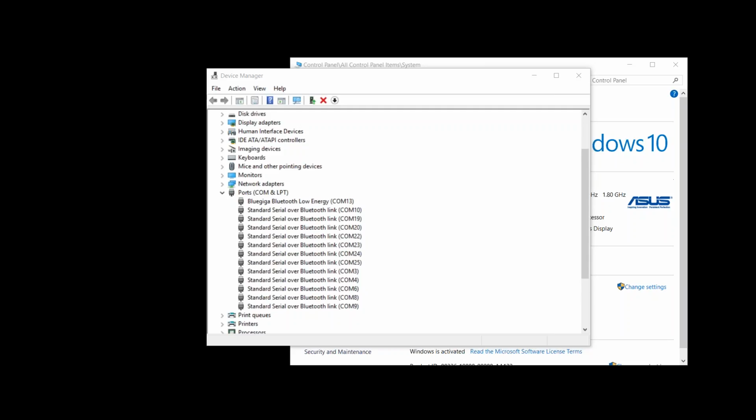But for the M-Cell Smart, if you check the back label, it says MBMS / and then 5 digits, then it's M-Cell Smart. And it also has the Bluetooth Smart logo. Then it is an M-Cell Smart, and the storage is quite a lot, something like 100 hours.